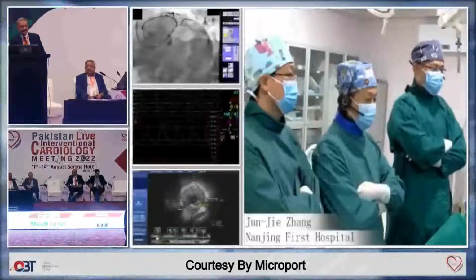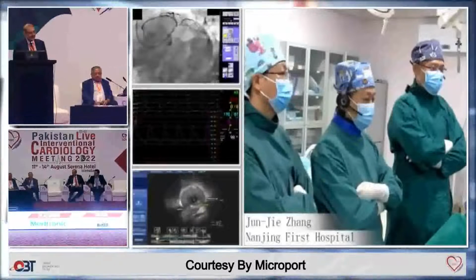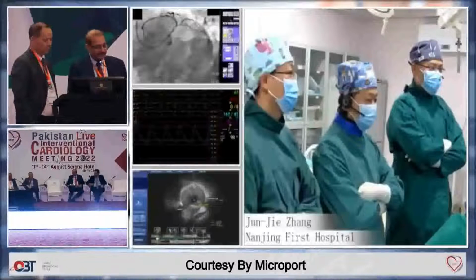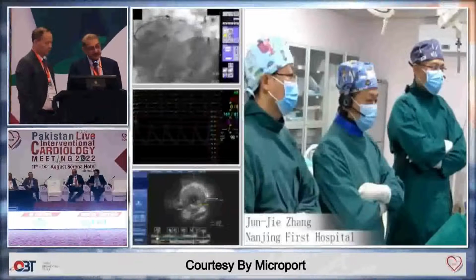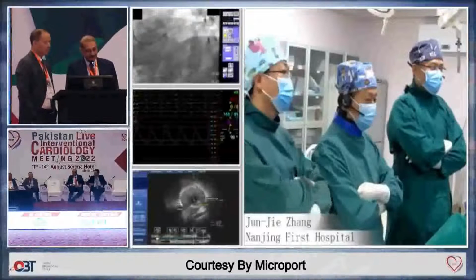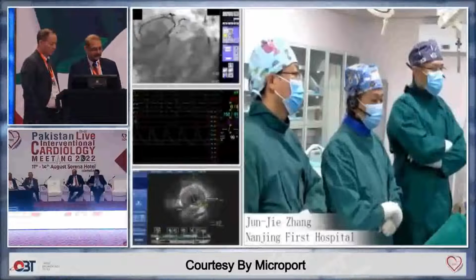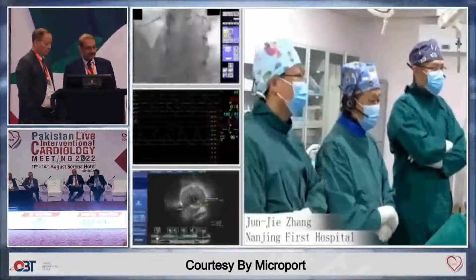Right, very nice case, very educative. It's bifurcation anatomy, a complex lesion. And one thing which I see is the OM branch is at a right angle. So hopefully it doesn't look to be ostial disease. So probably one suggestion is that we do just 3 wires, but maybe 1 or 2 stents.